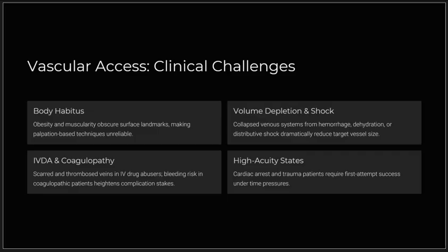We also have patients that come in in cardiac arrest or trauma patients that are very unstable that require first attempt success when we go to provide either a central line or peripheral IV. And we know that ultrasound increases the success rate of those procedures.